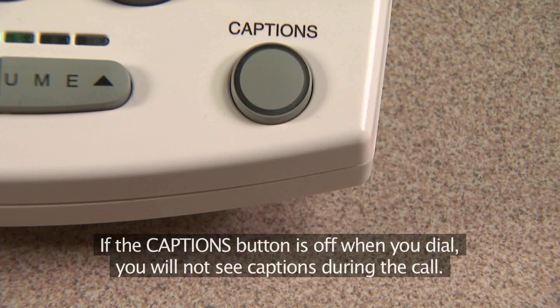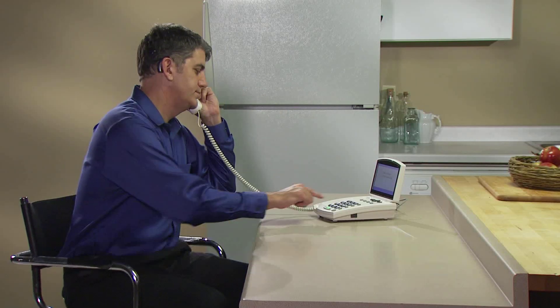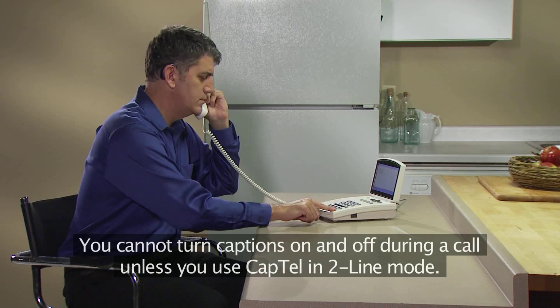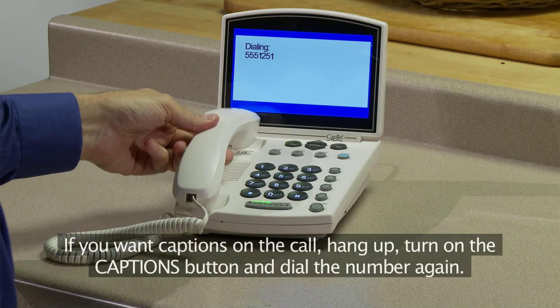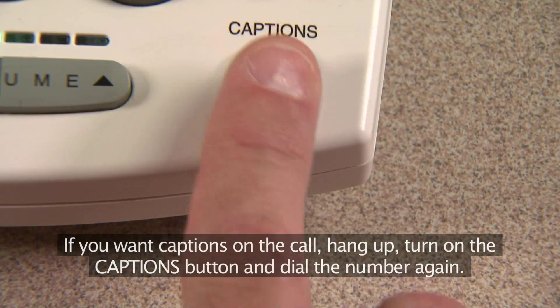If the captions button is off when you dial, you will not see captions during the call. You cannot turn captions on and off during a call unless you use CapTel in two-line mode. If you want captions on the call, hang up, turn on the captions button, and dial the number again.